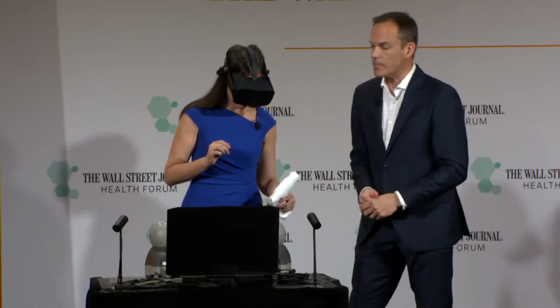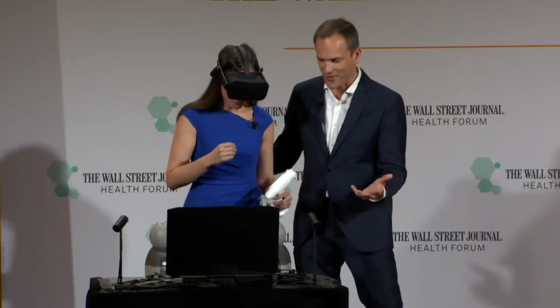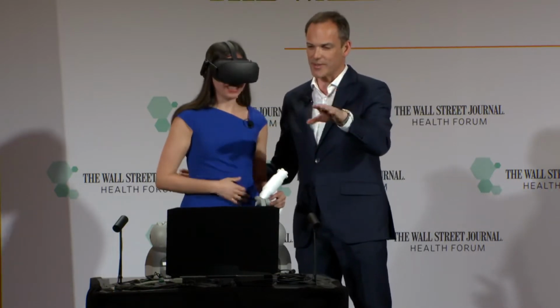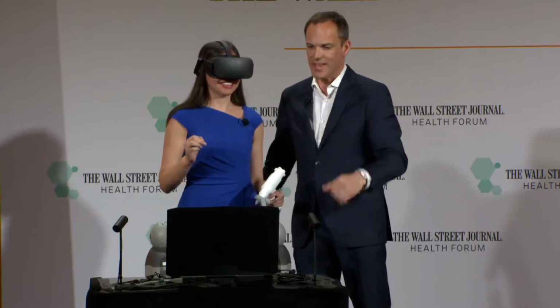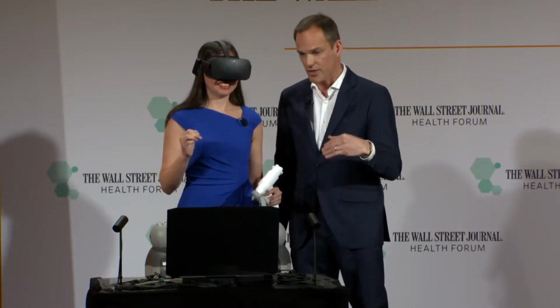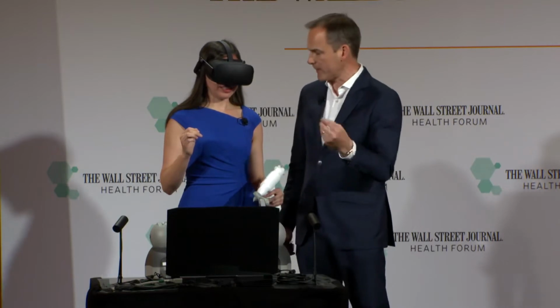Now you obviously don't know what you're doing as a non-qualified surgeon. I have no medical degree whatsoever. If you look up to the screen, you can see there's some instructions there. So basically it's telling you that you're going to need to ream the acetabula. It's talking about the angles of approach and how much you need to take off it. And perhaps we'll add a bit of a help overlay.